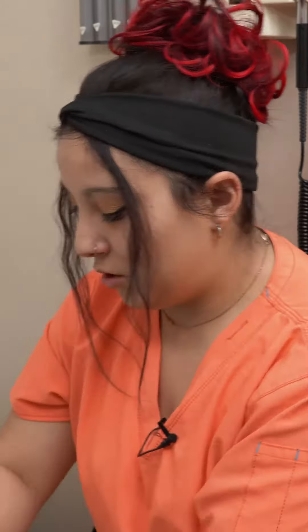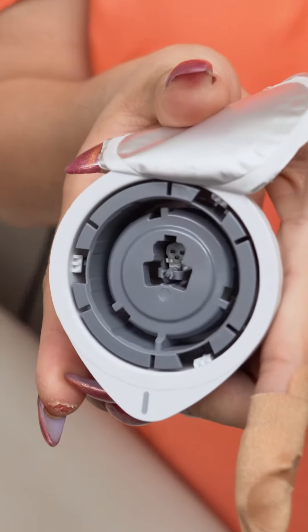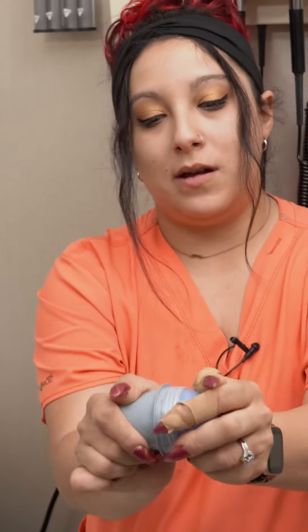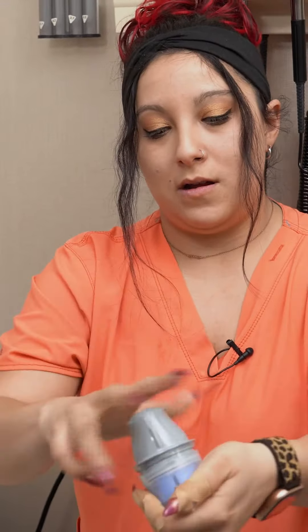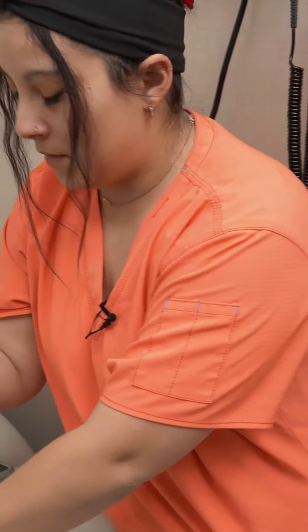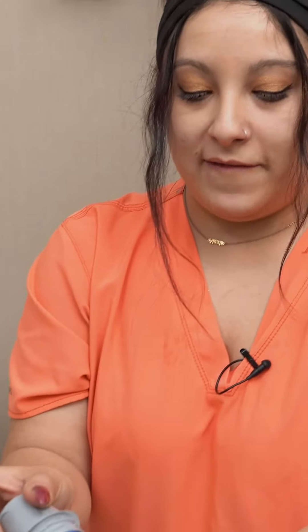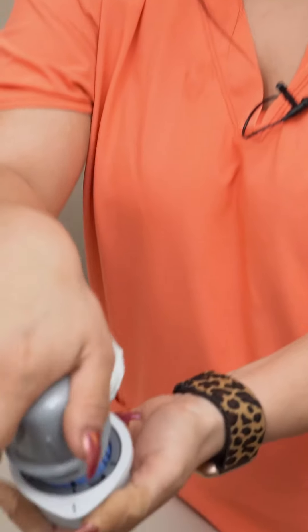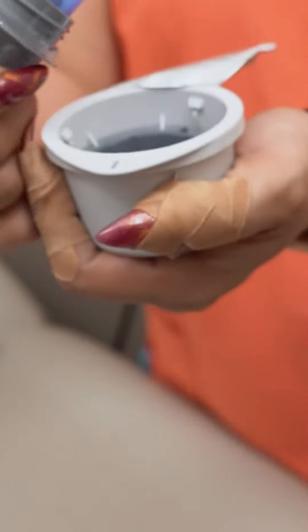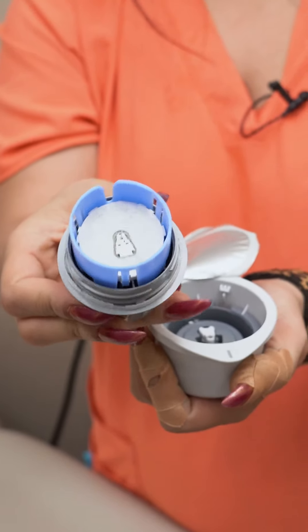When you open the new sensor, it'll look like that. You're going to unscrew the cap — this is the inside of your cap. This notch is going to fit in here, and you just push it down. You'll know you have it when you see the little needle inside the system.